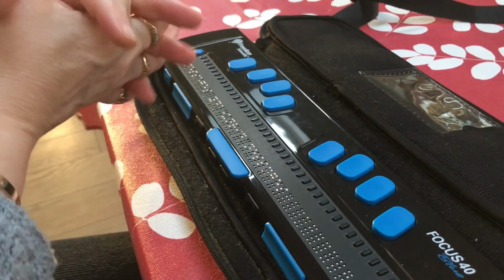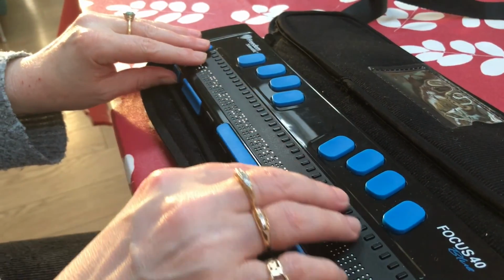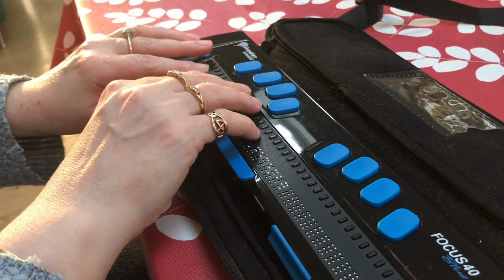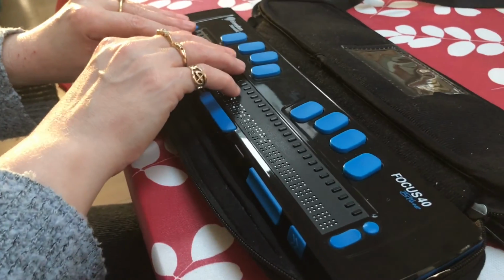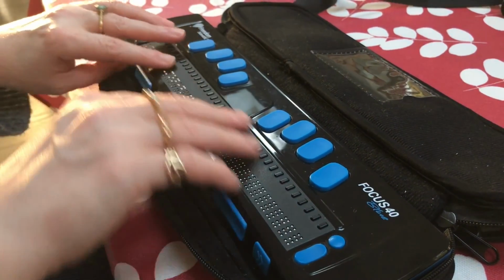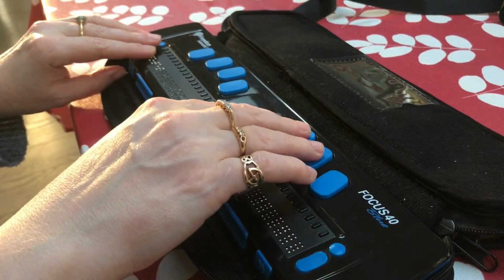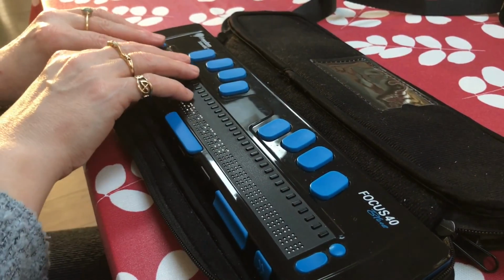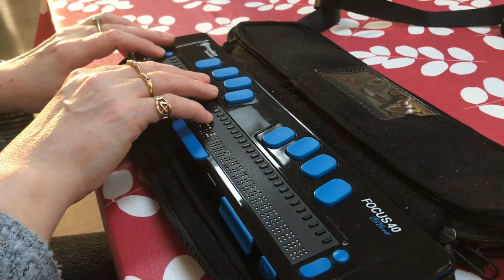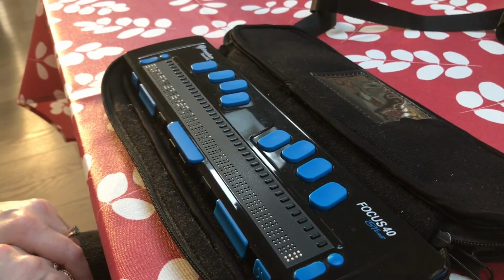So you can navigate the screen and the pages of your device with this Braille display with various navigation keys that are on it. So in front of me now, I can navigate through the apps that I've got here, such as messages, calendar, clock, photos, etc. And then I can also move between the pages of the device by pressing a key at the left hand side of the display, which navigates me through the pages, page 2, page 3, page 4, etc.